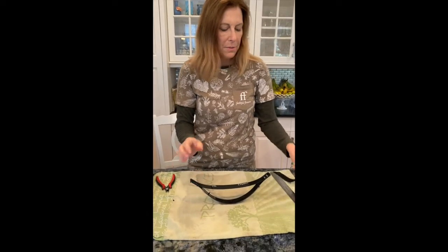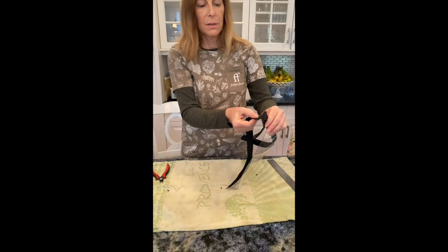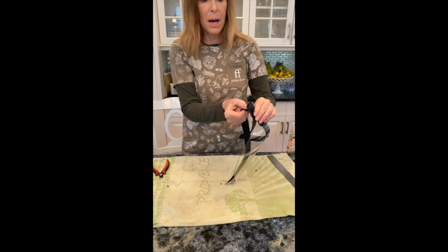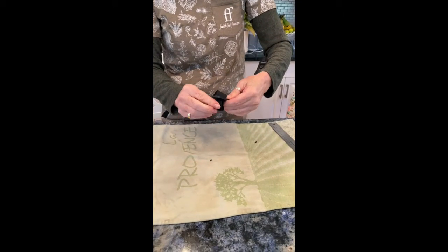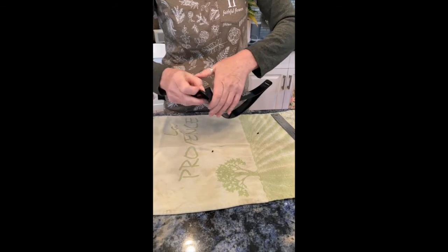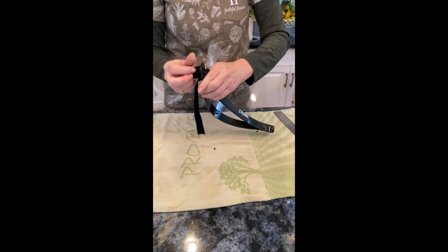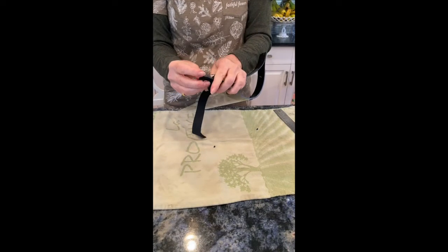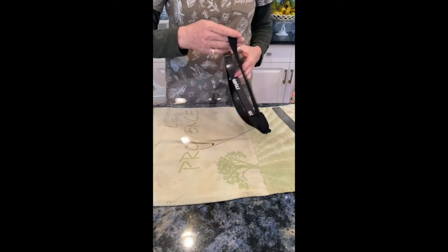Then we're going to take a piece of elastic that's about 14 inches and just feed it through. I've cut it on the bias so it's kind of easy to feed through the inside piece. And then bring it back on the outside. You can see it's cut on the bias, it should go through pretty easily. And do the same on the other side.